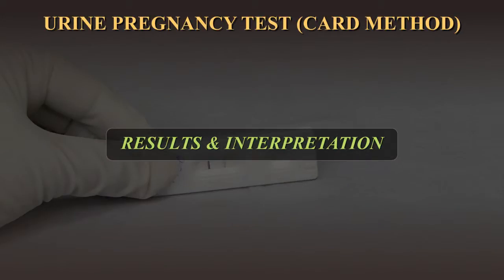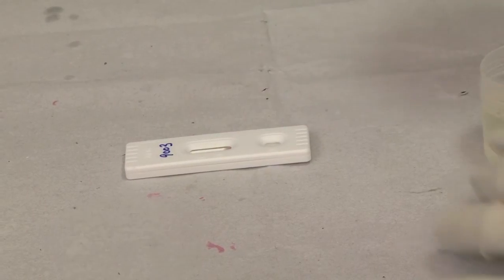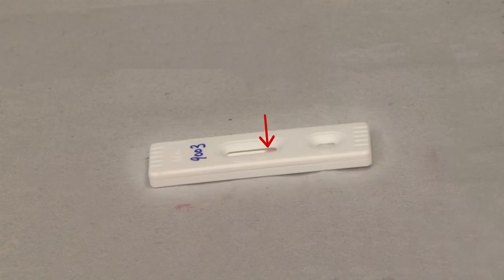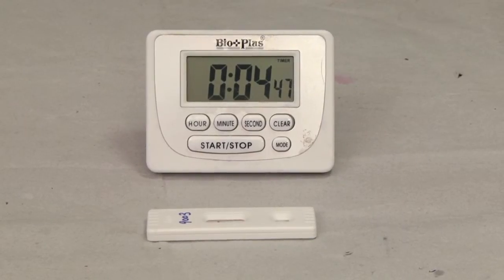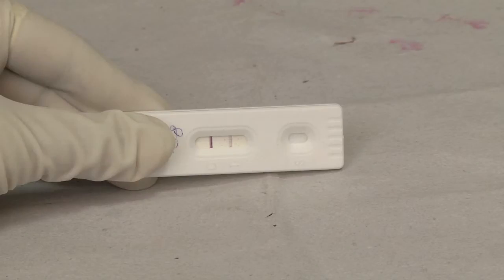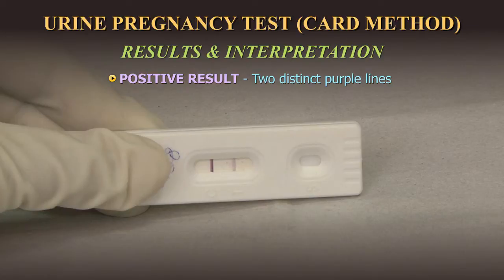Results and Interpretation: Once you finish addition of the urine sample, you can observe it flowing across the result window. Observe the result window for the appearance of lines and interpret the result. The lines start appearing within a few seconds after the sample flows across the result window. A positive result is indicated by two distinct purple lines in the result window, one at C and one at T. The result for a positive urine sample appears within two minutes.